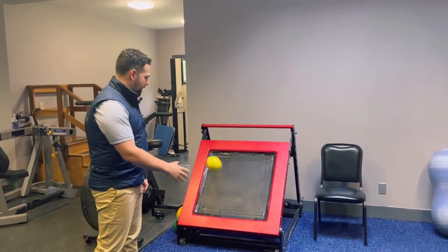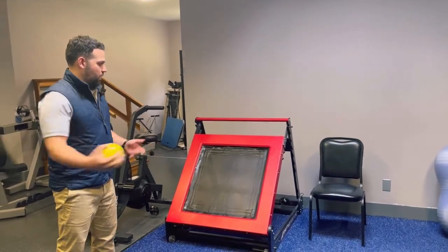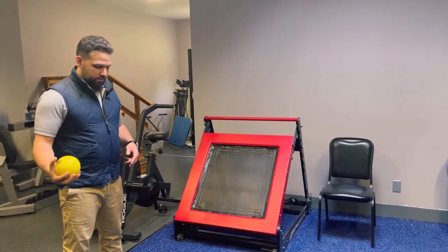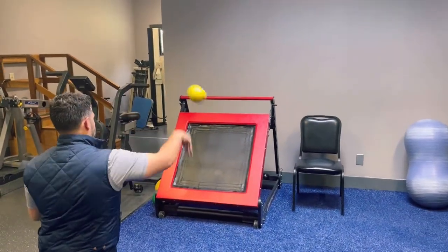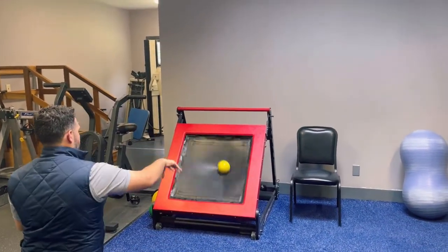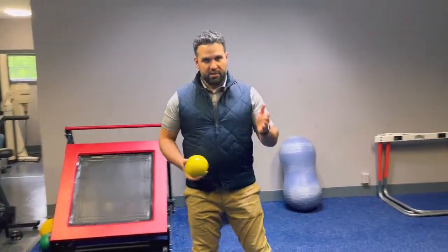I might just go to the side and work on tossing the ball against the rebounder. We can do it in different positions — we can do it in kneeling — just to work on conditioning the arm.